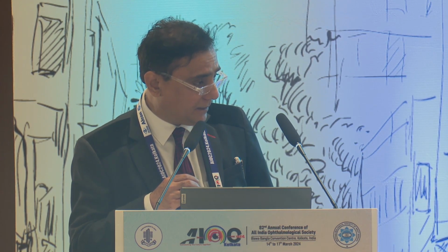gets his presentation fixed. If a person has increased corneal epithelial thickness and you're going to do an enhancement for this patient, the patient's epithelial thickness is more than normal, he has a residual refractive error and you're going to do enhancement, would you prefer to do a PRK or would you prefer to do a flap?